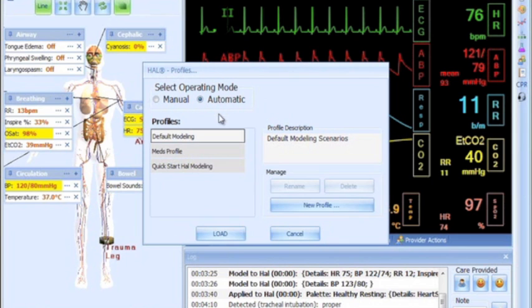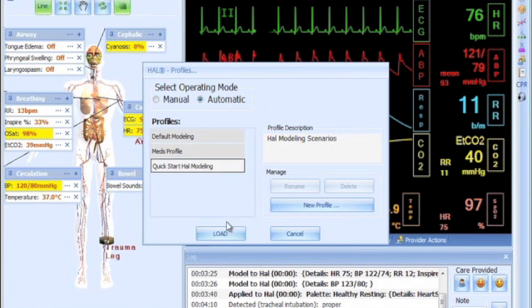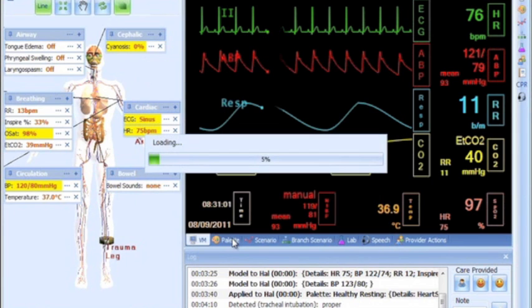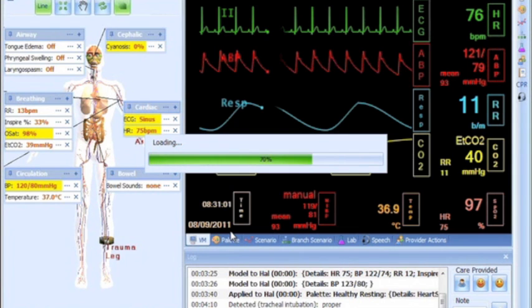Automatic mode: In this mode, vital signs respond automatically to care providers' participation, instructor's specifications, and pharmacologic intervention.